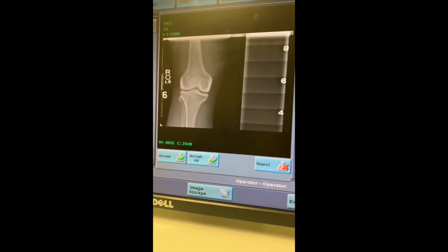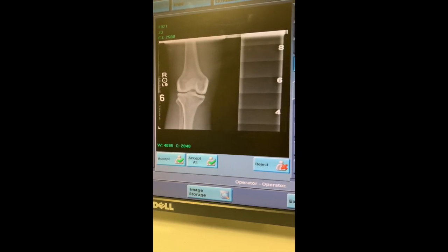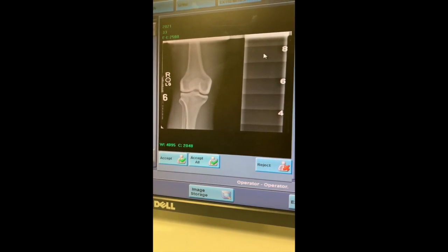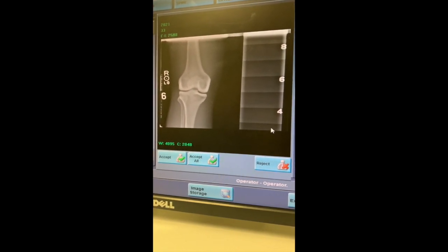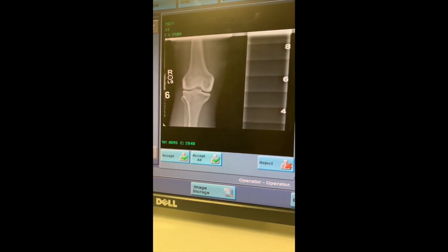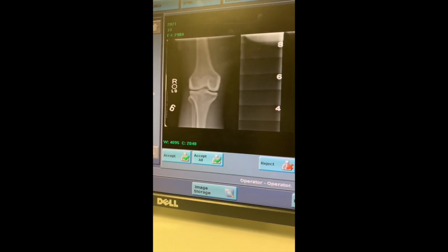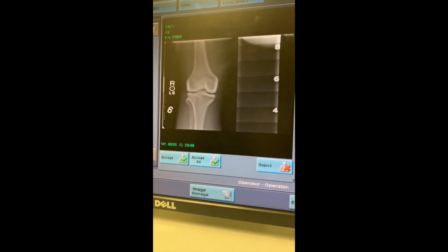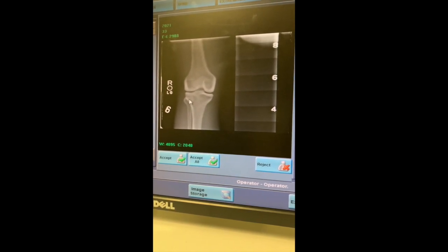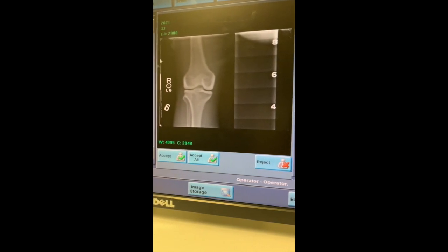Next one, boom, we got our step wedge back. This one was done at 95 kVp. 2508 is our exposure index number, but you see how you can still see all the different levels. This shows the latitude that this system has, and digital imaging has in general. And then the last set, this one's done at 110 kVp. I think it might have been moving a little bit, so if it looks a little blurry to you, it looks blurry to me. Exposure index now is 2988.